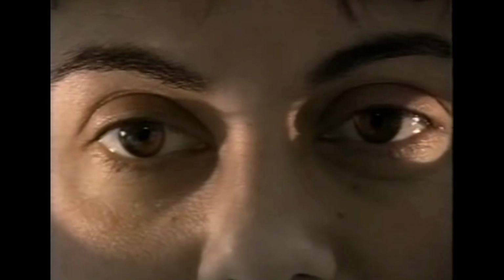Next is the pupillary examination. While your patient fixates on a distant target, look at the size and shape of each pupil. Shine your light into one of the eyes. This should cause constriction of the pupils in both eyes.